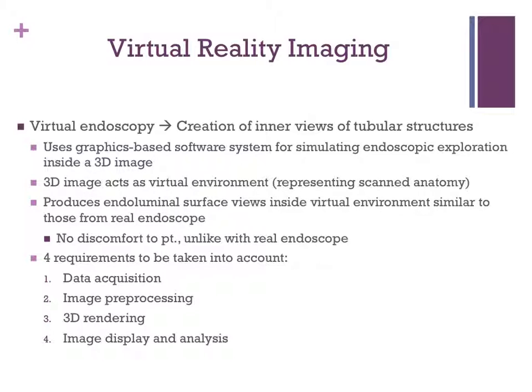It allows for unrestricted exploration, and when a real endoscope is used, the patient may feel some discomfort during the actual procedure. This obviously doesn't occur in virtual endoscopy because there is no physical device used. Four fundamental requirements must be taken into account in CT virtual endoscopy, which are data acquisition, image preprocessing, 3D rendering, and image display and analysis.